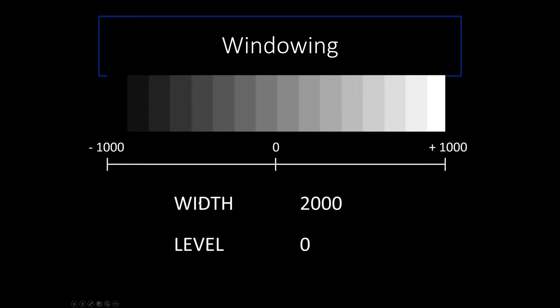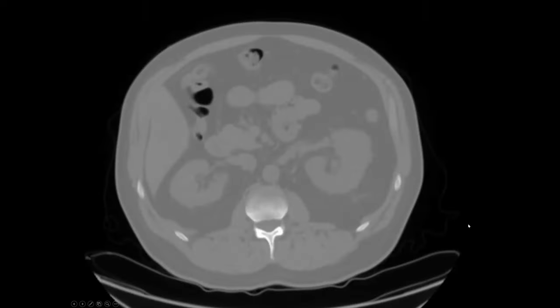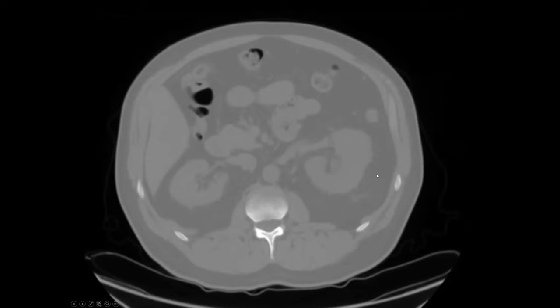The principle of windowing is how we distribute those shades of gray across the Hounsfield scale. Two numbers define any window — the width (W) and the level (L), which you'll see at the bottom of any CT scan. The level is the center point of the window, and the width is how broad the range is. For example, a window centered at zero spanning negative 1,000 to positive 1,000 has a width of 2,000 and a level of zero. With this very broad window, everything looks washed out, but gas at negative 1,000 clearly stands out.